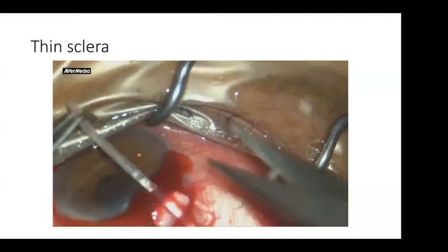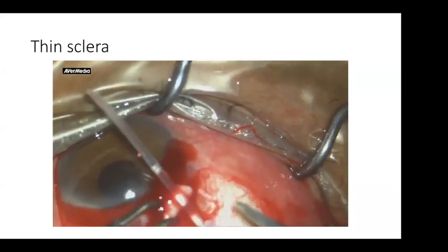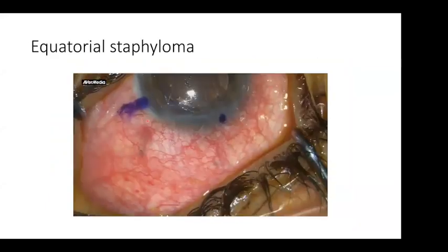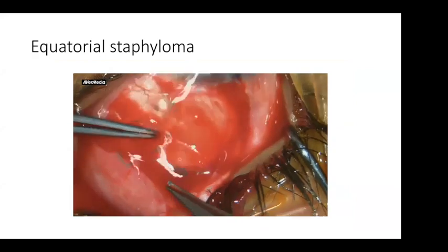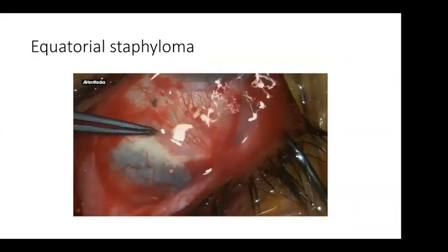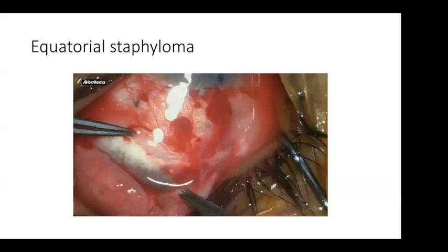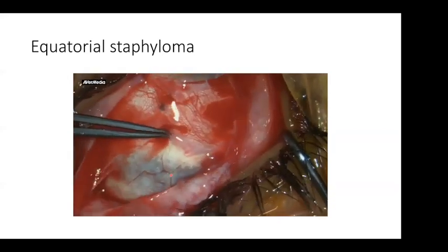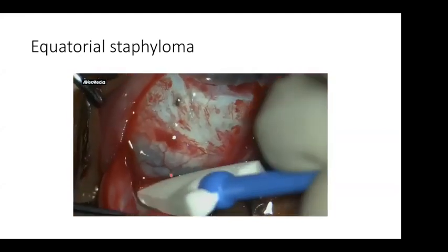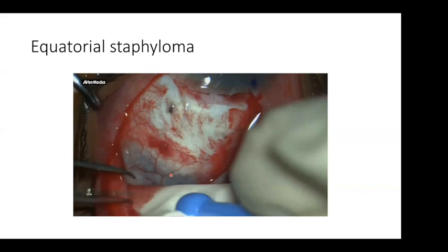serious in the eye. Now, this is a more serious situation, a patient with an anterior chamber lens, and everything is normal. The conjunctiva looks very redundant, good conjunctiva, but look at the sclera, you have a surprise. So again, when you do the valves, you can have some surprises like that. The patient preoperatively doesn't have any problem. There is no retinal detachment, there is no choroidal mass. But again, you can see something.